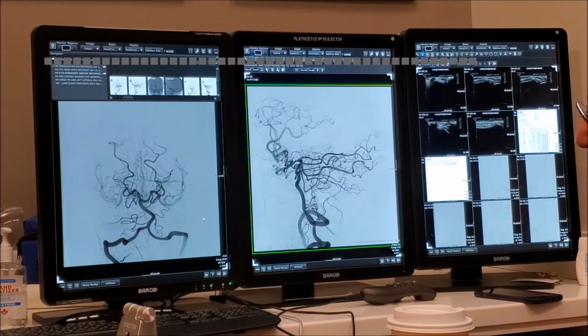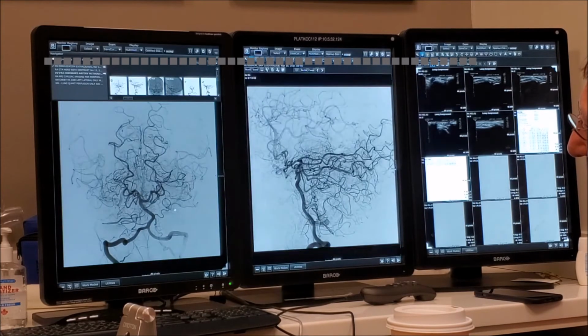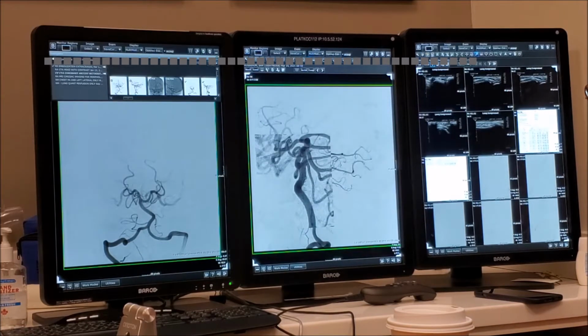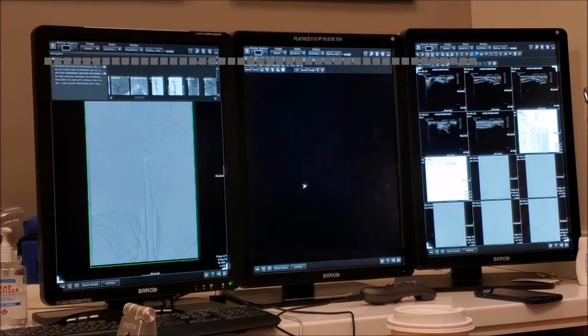So you did this other view. Yeah. Okay, we see this lateral spinal. Okay. So what? There's nothing here. Did you think this was something? No. See this little bump here? Okay. Go to next. So we go to the bifurcation.